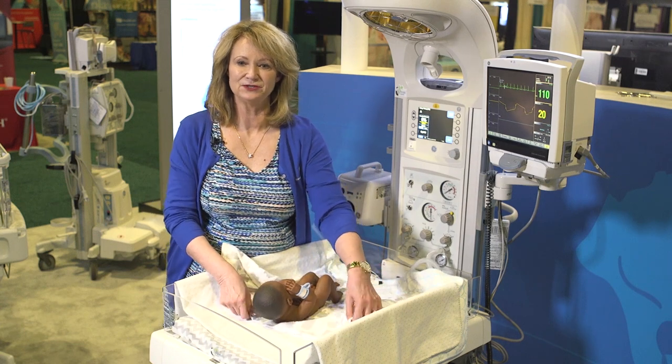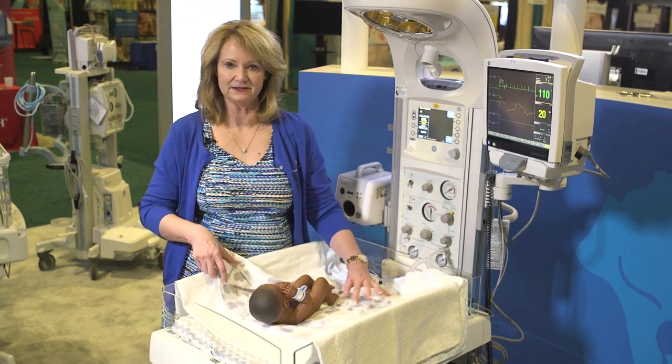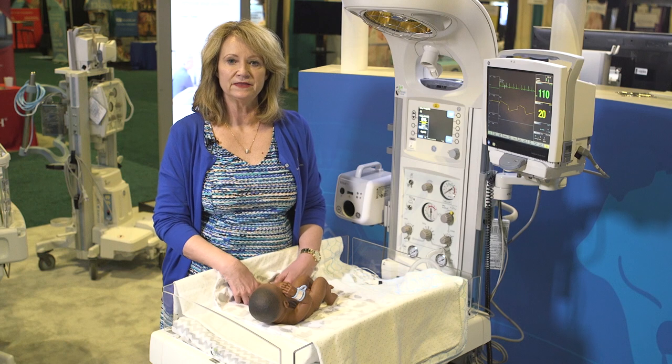Hello, I'm Norma. I wanted to share with you some tips today on getting consistent weights with the Panda Warmer.